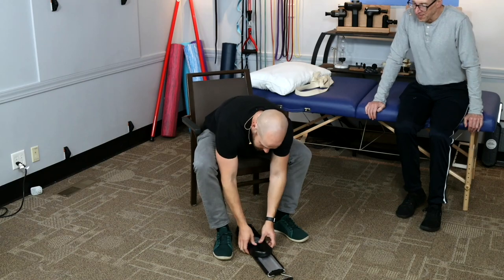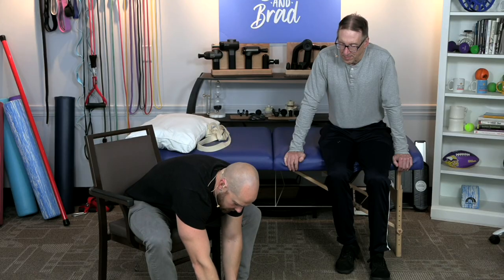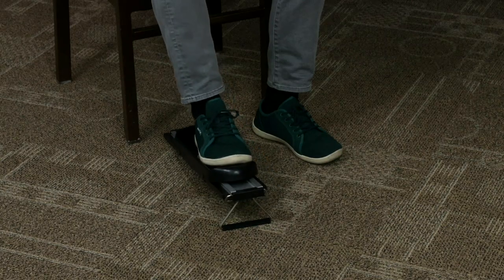If you want to challenge your quads a little more, you can put the kickstand up and go uphill. This makes it a little more challenging. And you can also see the benefit here on the ankle too.